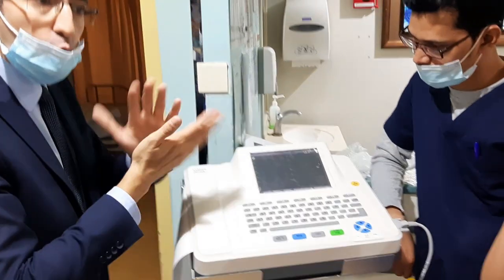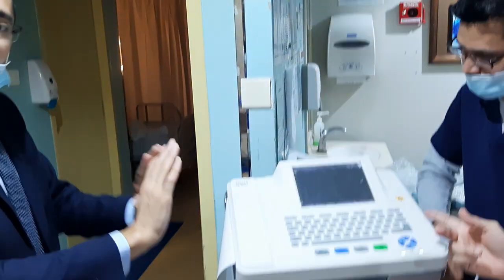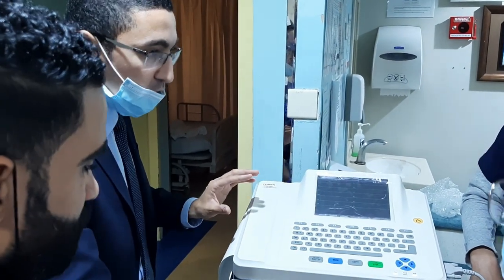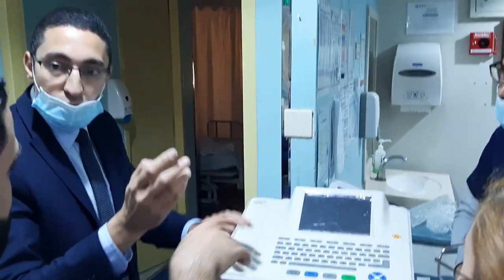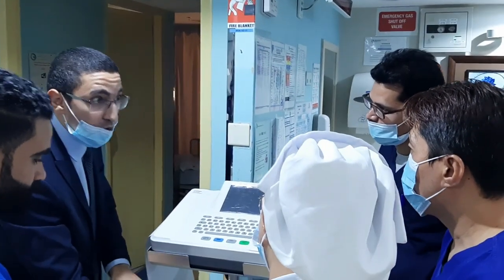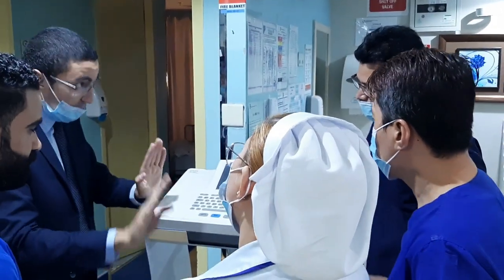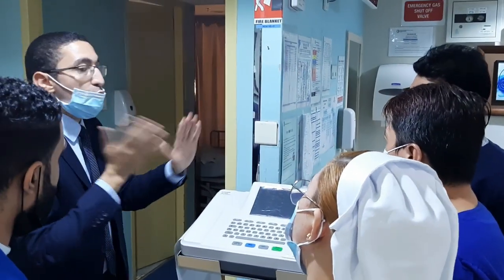So now you know all the steps about the device, how to use the machine. It's very easy. Step number one: register, or you can connect the cables, whatever you want. So the first step, you enter the patient data. Second step, you connect the cable. Third step, you check that all are green. Fourth step, you can print. So four steps only. It's not a big deal.